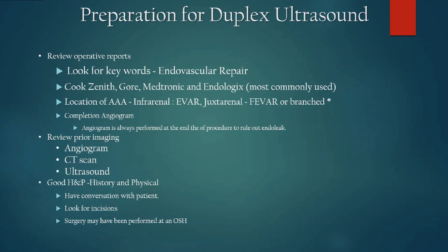So as sonographers, to perform this study, there are a few things that are extremely important to have. It's important to have the operative note. So if you know these studies are on your schedule and you're not in a lab that is working right next to your clinic of doctors, it's important to get the operative notes and review them. And when you're reviewing the operative notes, these are some helpful hints.